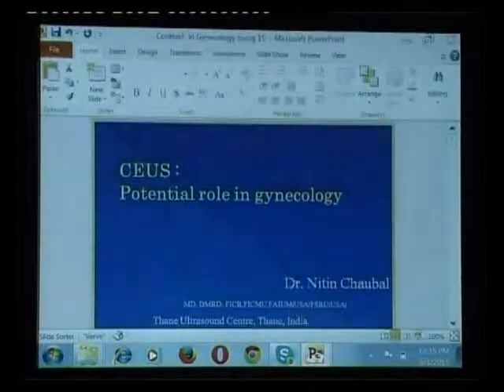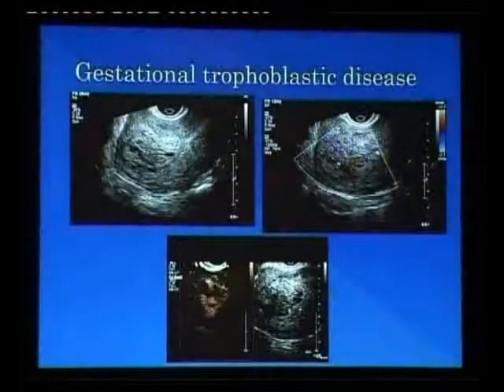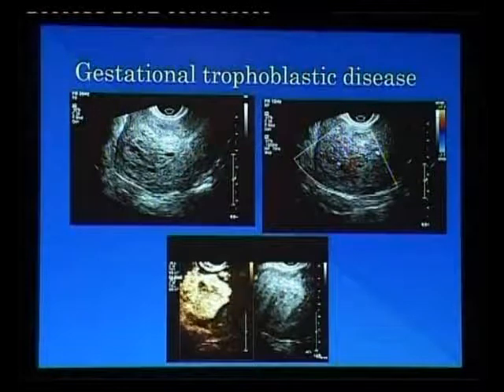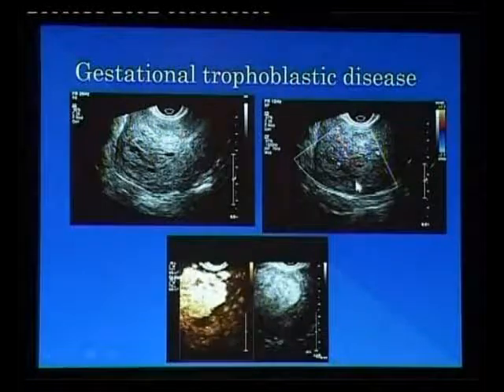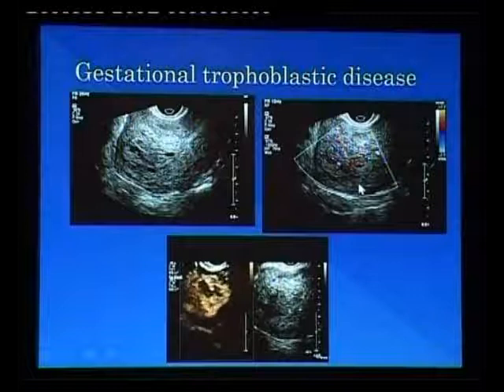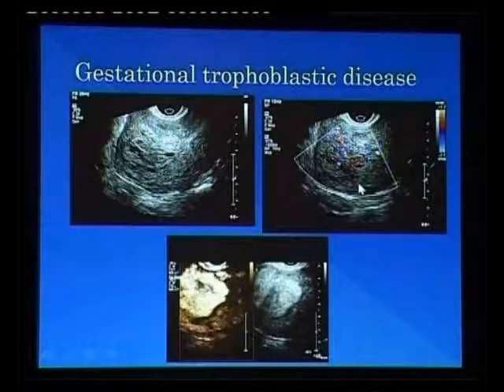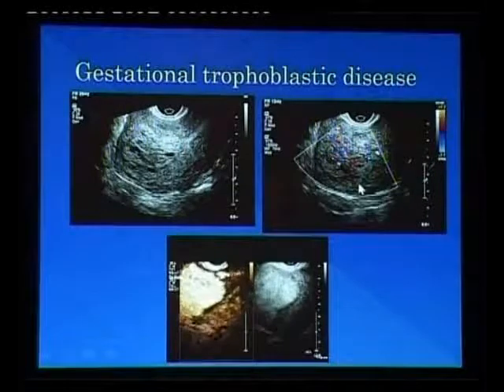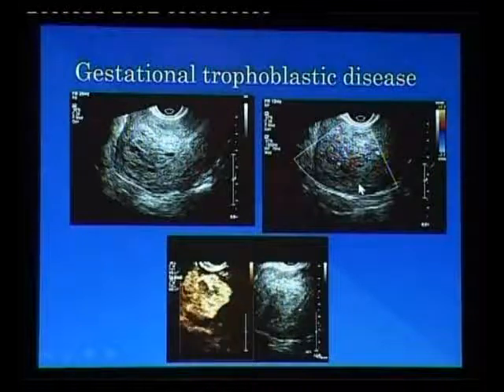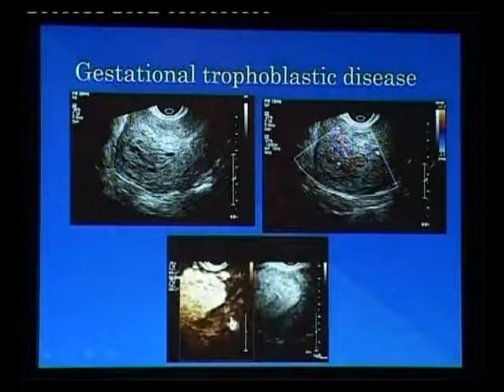in gynecology. In gynec, in fact, if you look at the applications which we have been doing in the last few years, they are really wide. But the basic principle is the same. When color Doppler came, we thought, wow, we have got something which will tell us blood flow at all levels. And we were excited, and we started using color Doppler at all points. But color Doppler does not show us microvascular blood flow. It does not show us blood flow at a capillary level, which is what we want to see. And contrast, on the other hand, does that.